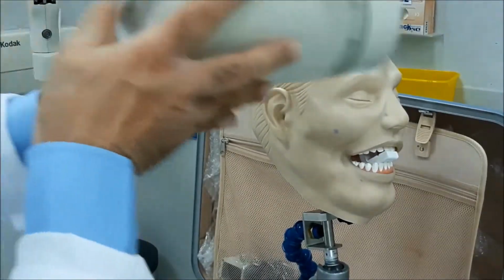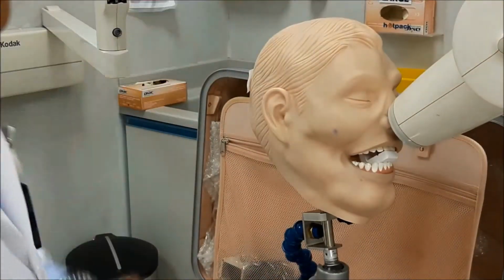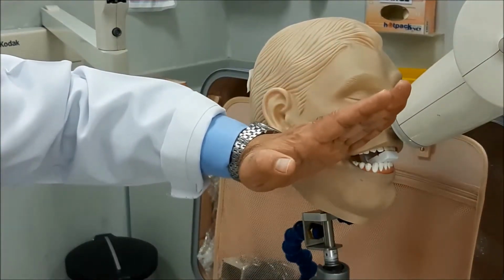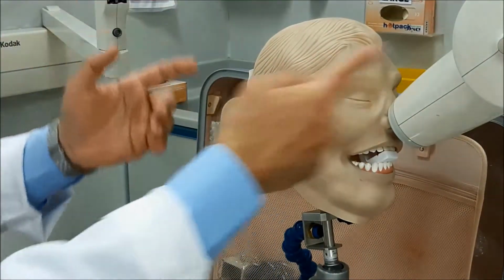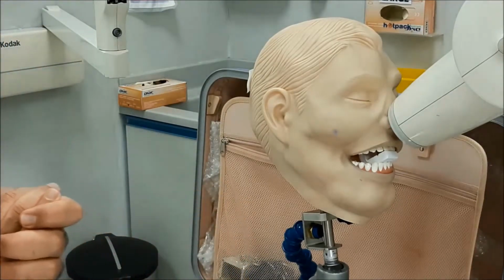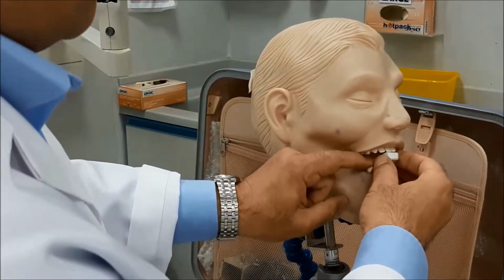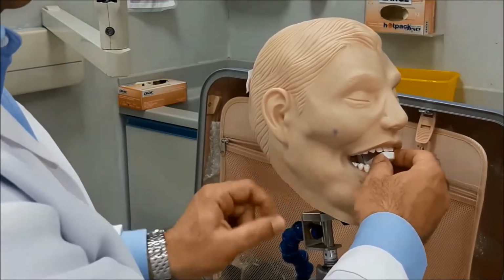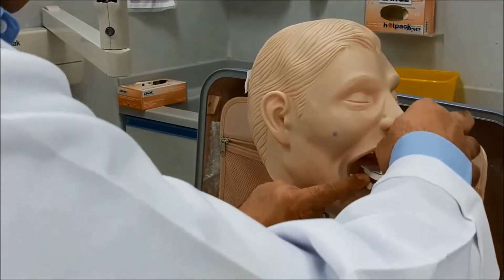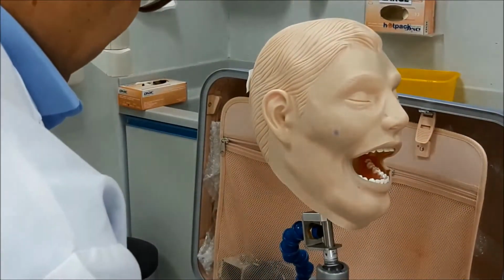I will just show you how it looks from the side, so you will have an idea about the beam direction. So again, this is how you would direct your beam. The beam will be falling perpendicular on the tooth and the film. This is how you would direct the beam on the film and the sensor. After you're done, you remove your X-ray beam out of the way and ask the patient to open. Again, as we did earlier with the previous sensor holders, you take the X-ray away so that you will not touch the oral cavity inside.